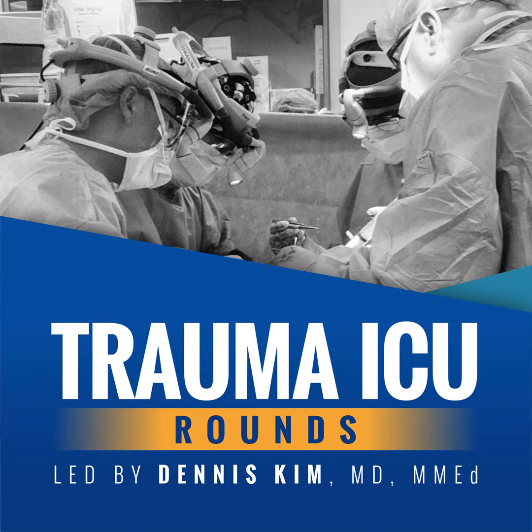But between mandatory breaths, patients can breathe spontaneously without receiving a mandatory breath at 500 cc tidal volume. In general, these quote-unquote spontaneous breaths are actually assisted breaths, as we usually offset some of the work of breathing due to the resistance in the ventilator circuit with the baseline pressure support, usually somewhere on the order of around 10 centimeters of water.